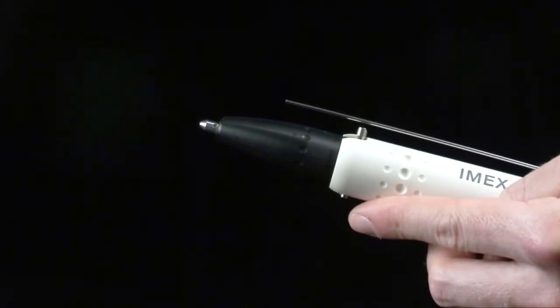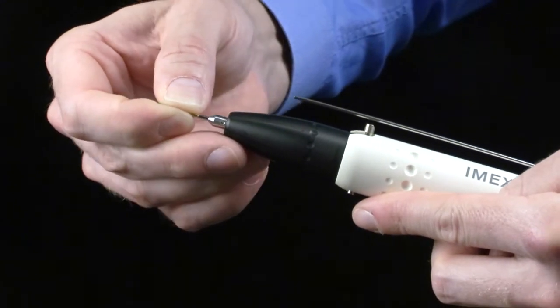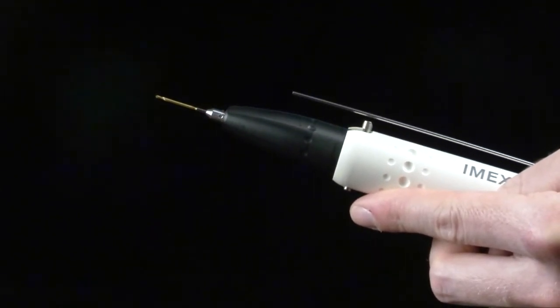Select a 1.15 mm drill bit and load it into the micro drill by aligning the taper of the drill bit shaft with the offset pin in the chuck.